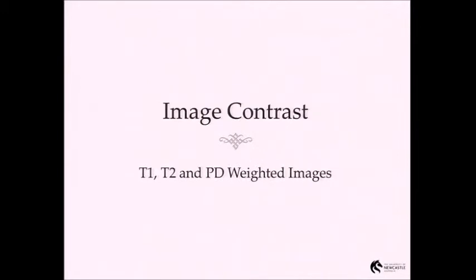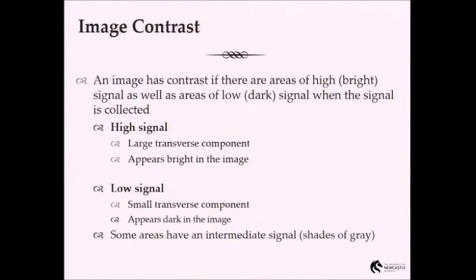So a little bit about image contrast. Remember I gave you a definition yesterday: contrast resolution is the ability to tell two similar tissue types sitting next to one another apart. So that's what MR is really good for, contrast resolution. And I'll show you some more images. We saw that a little bit yesterday in the brain where we had T1, PD and T2. And on some of those we can better differentiate grey matter from white matter.